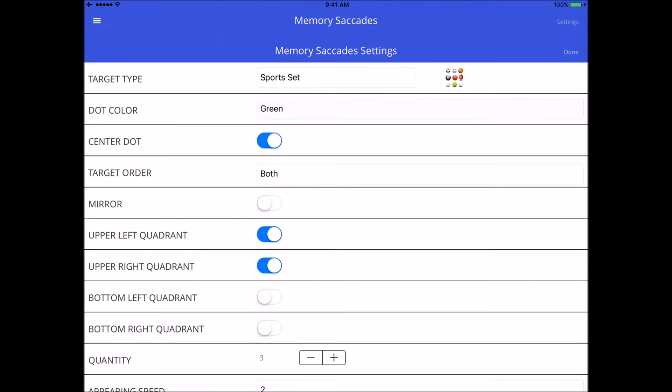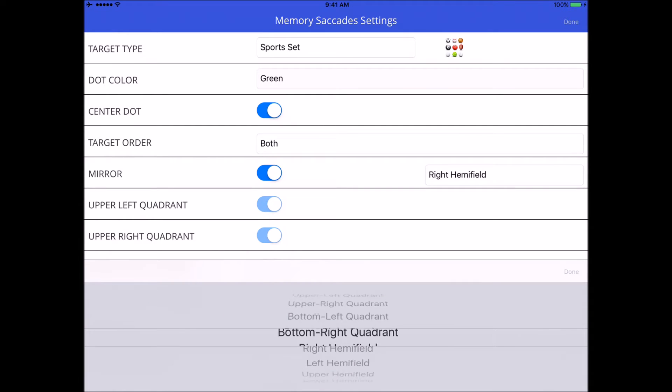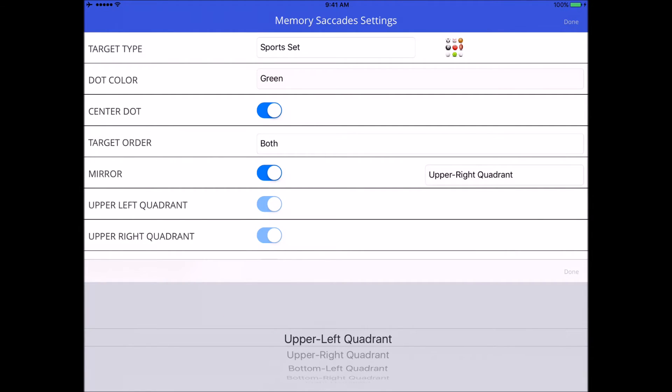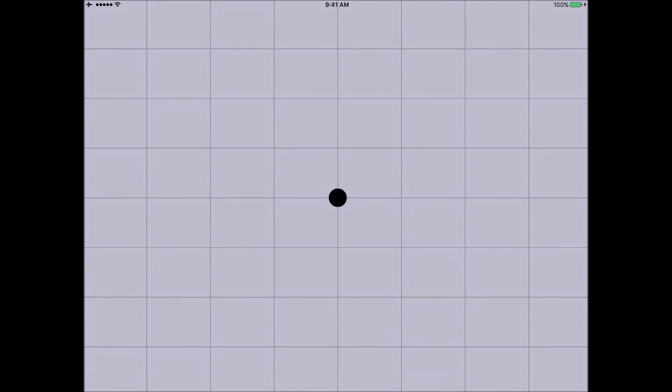Naturally your patients will get better at these over time, so you'll want to make it harder. When you turn on mirror, you have the option to pick the quadrant or hemifields where the dots appear. I'm going to pick upper right quadrant, set it to two targets to make it go quicker, and change the target set to monsters so you can see what that looks like.